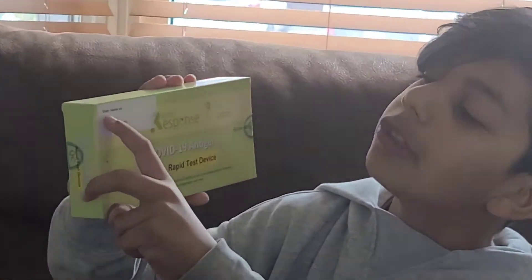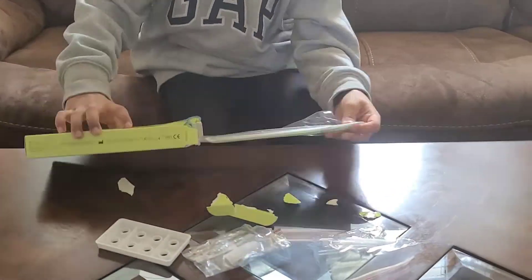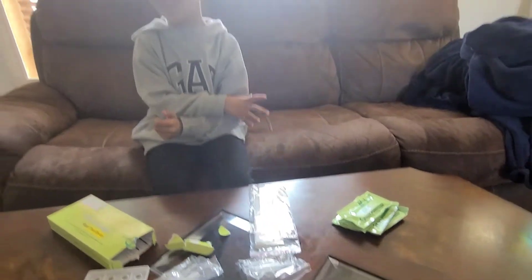Look at my name tag. Open the box. Oh my god — five packs for five times.